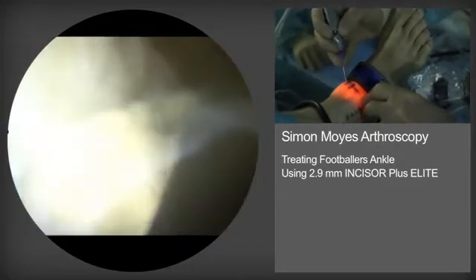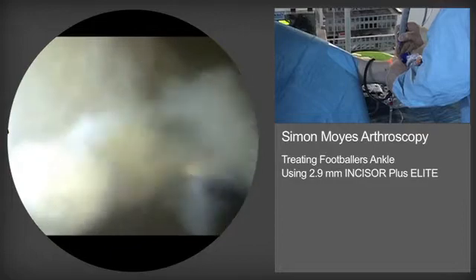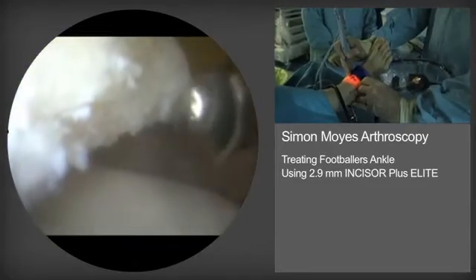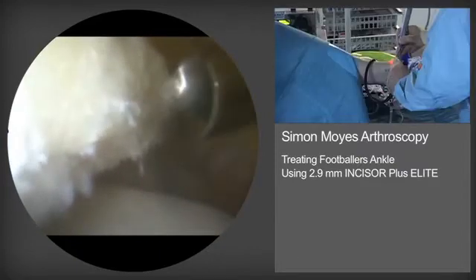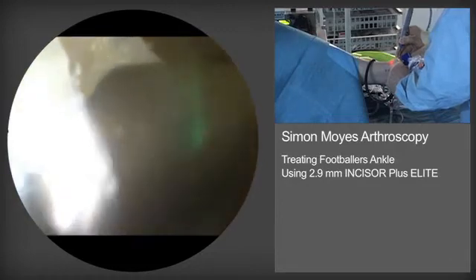On this occasion we are viewing antrolaterally and instrumenting antromedially. One carefully controls the pressure of the burr on the bony tissue and also keeps the burr away from the articular cartilage.